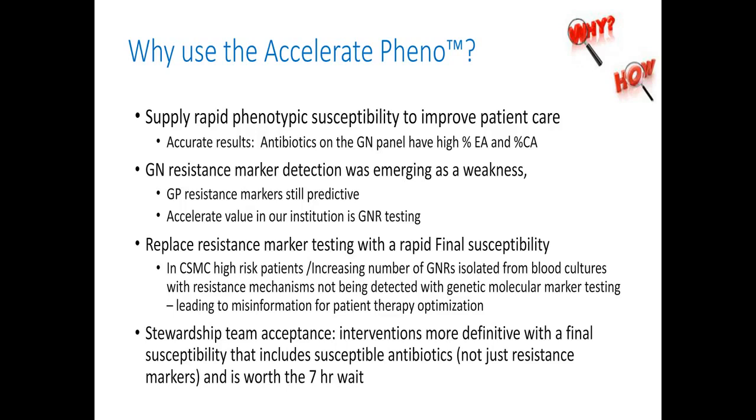Also, we need to provide potential budget issues for the laboratory, but also how this could save money for the hospital. Perhaps show literature, if available, how this has worked out in other institutions. Also, do you have staff ready and able that you can do this technology? Are they technically able to do the verification studies and all the patient testing?